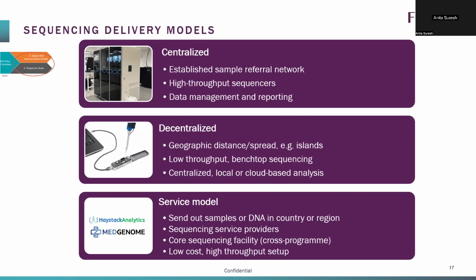This may not work in all settings, based on geographies and funding and setup of health systems. But this is a model that definitely allows for use of these higher throughput sequencers and gets the maximum, where your cost is obviously going to be lower per sample.